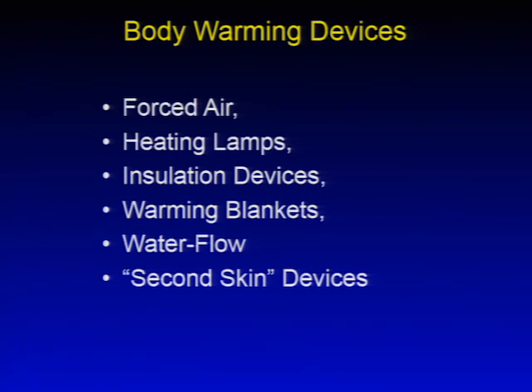We have a number of warming devices intraoperatively or perioperatively. One is forced air, a heat lamp, insulation devices, a warming blanket, water flow, and second skin devices.